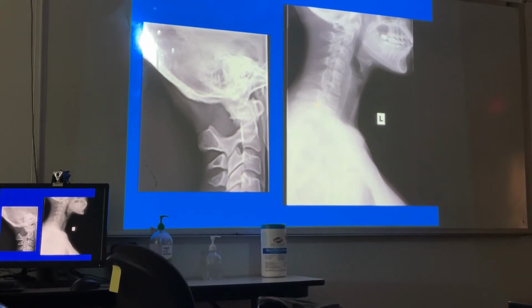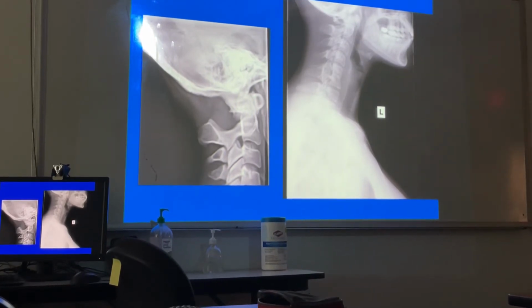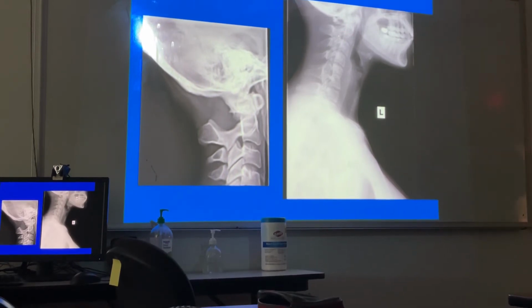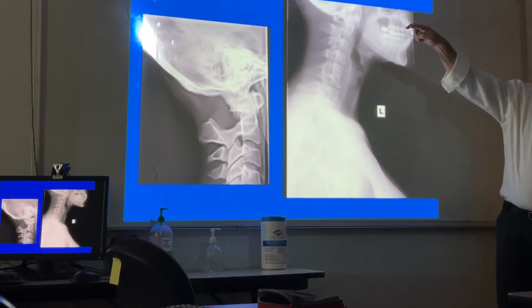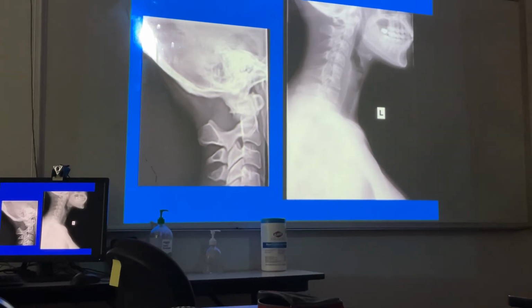All right, this one? Block vertebral body, C5 and 6. Okay, complete or incomplete? Well, okay, you need flexion, because I don't see a joint space between this and these spinous processes are approximated, all right? I just saw one this morning between 2 and 3. C2 and 3 were sharing one spinous process. All right, so you know what to do. Okay, this is not unusual either. Instead of this posterior neural arch, it's just laterally flexed a little bit. Okay, a normal variant in terms of presentation.